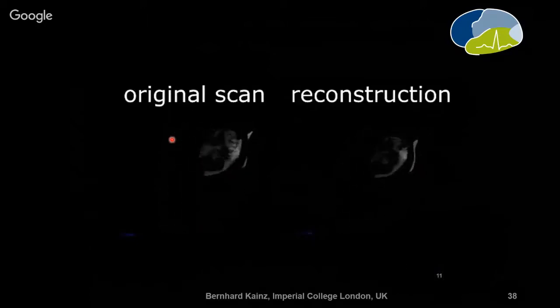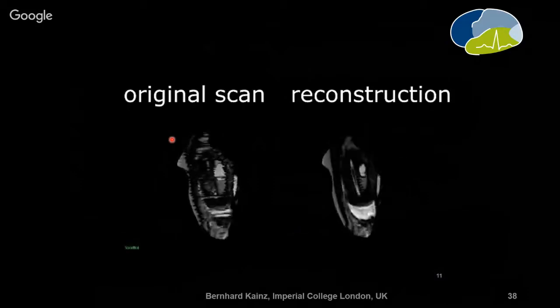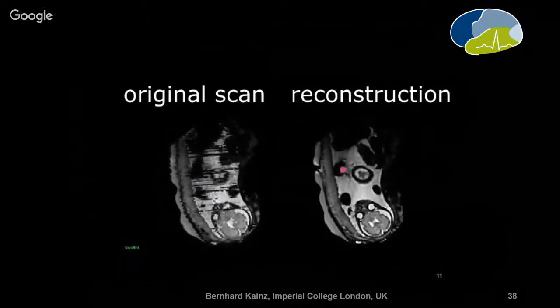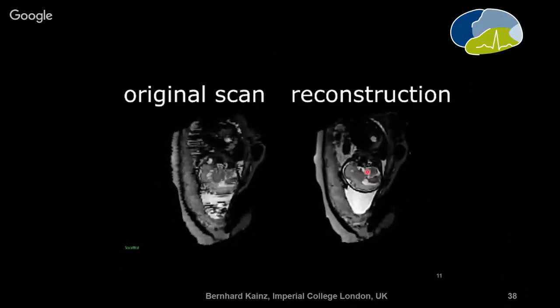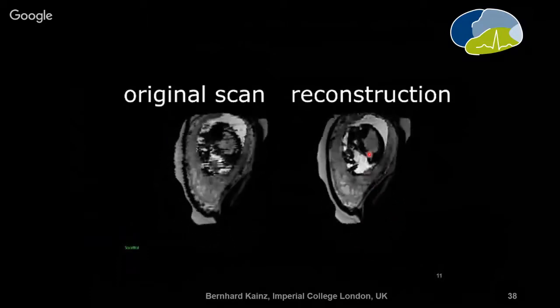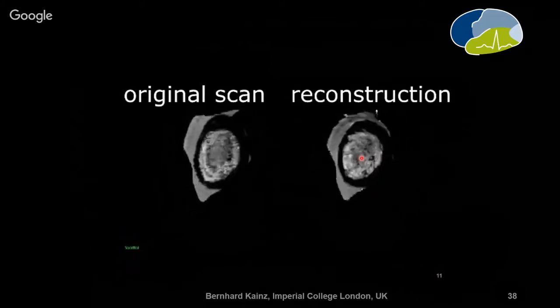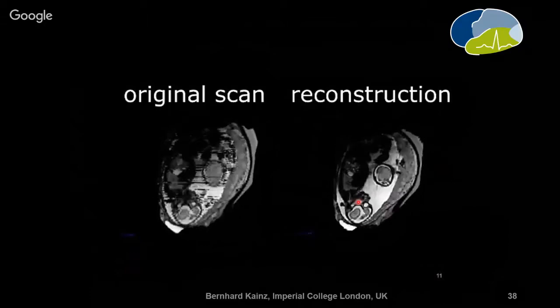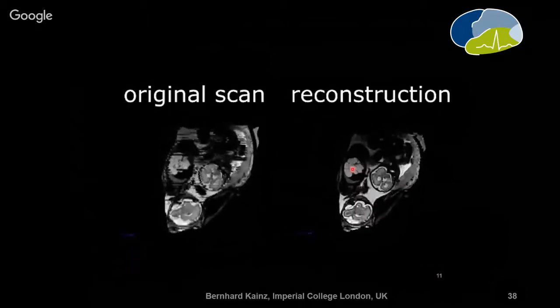So these are twins in the uterus, and if we just reconstruct the whole uterus, we have everything we are interested in at once. So what we can see here is the fetal brain, and there is another fetal brain from the other fetus. This is the lung from the other fetus. This is the placenta around here. And if you look closely, the first fetus here has some problem with the kidney.